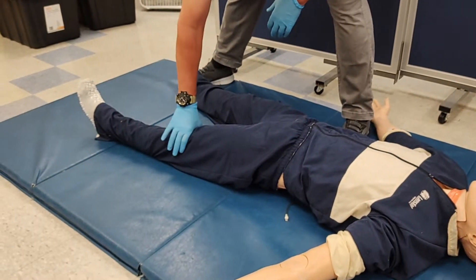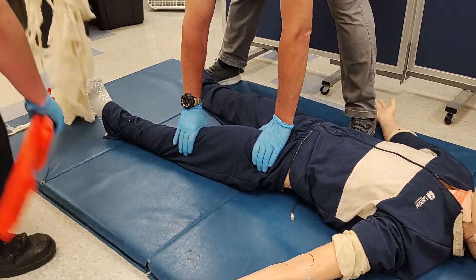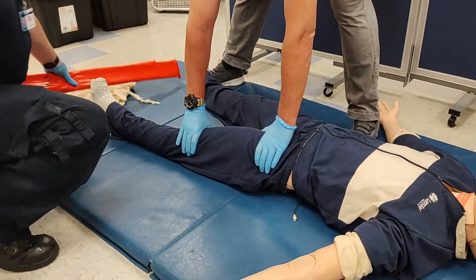For a patient in need of hip immobilization, we begin with manual stabilization of the limb, controlling the area both above and below the injury.